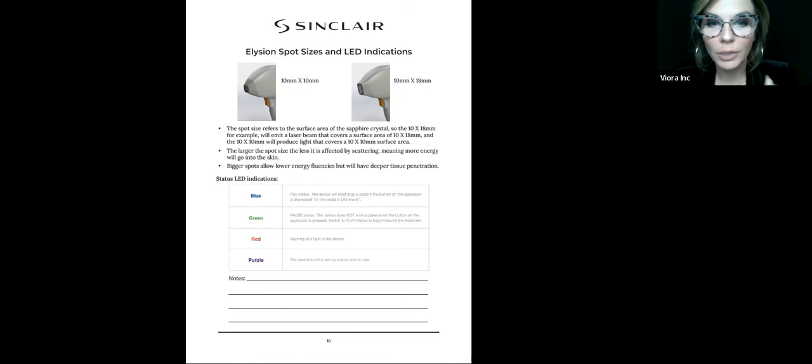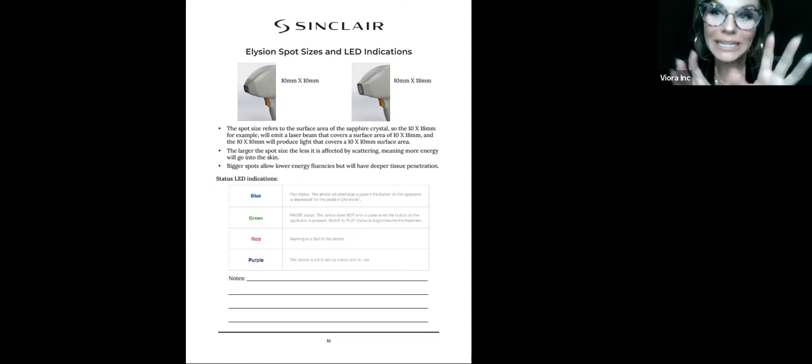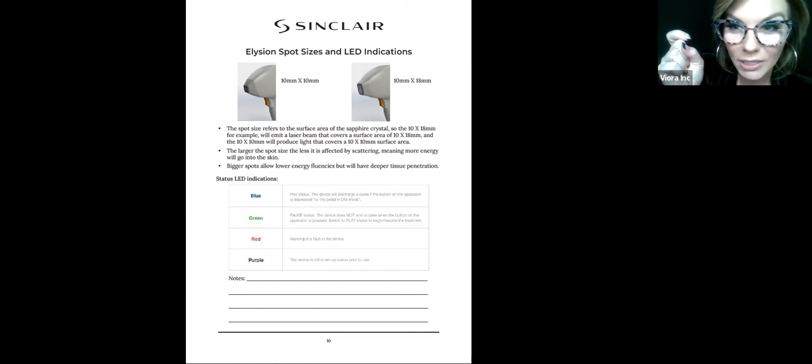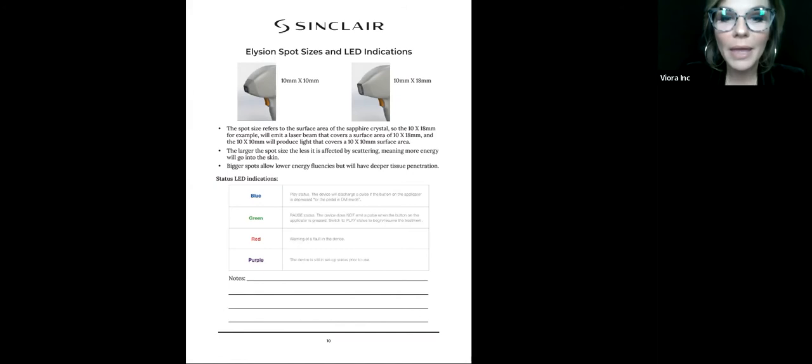A lot of times when you hang up the handpiece, it will go into that standby mode for safety, green. So when you pick it up and you go to trigger, why isn't it going? It's because you haven't started it yet. The way to start it is just to hold down the trigger and then you'll see it turn blue and then it's ready to go. And then red is warning of a fault in the device, which I have never seen. I don't think that happens, rarely, ever, maybe. I've never seen it, but it's good that we have that. It's warning you. And then purple, the device is still in setup mode prior to use. So when it's calibrating, it will be purple.